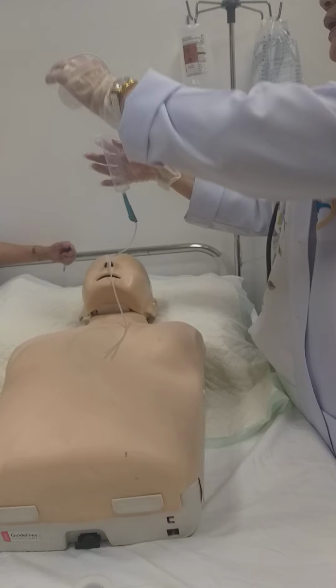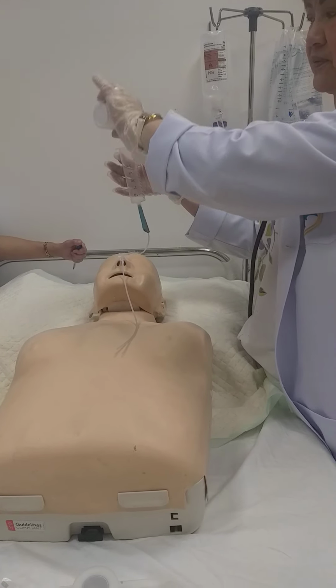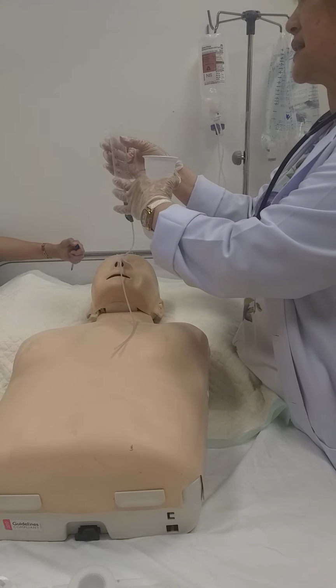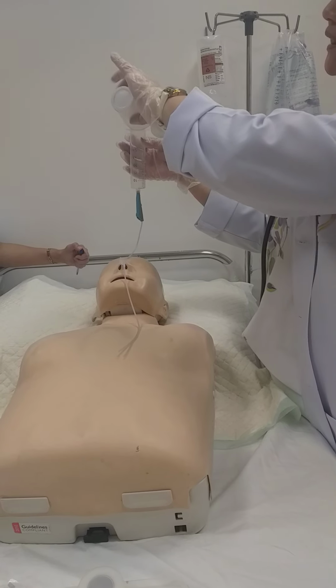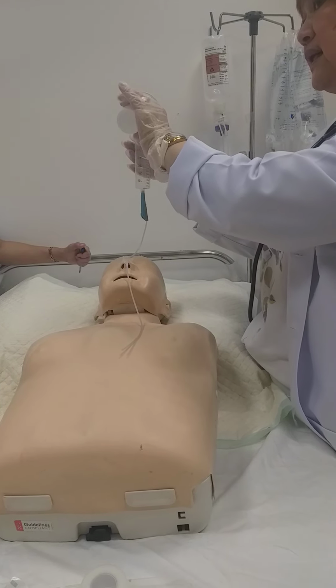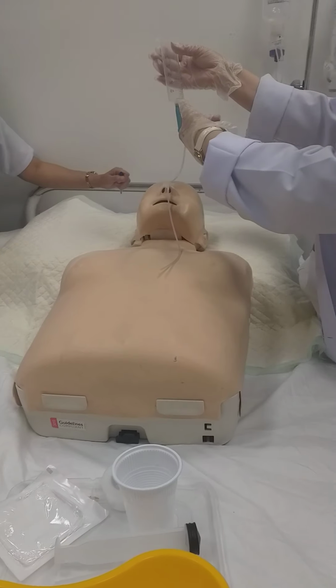So let's give 50, finish, 50, 50, 50. Done. 300 according to the doctor. Now, once it is done, flush with water. Another water, how much? 30 to 50, but we are giving only 30. Okay? So done. Water is done.